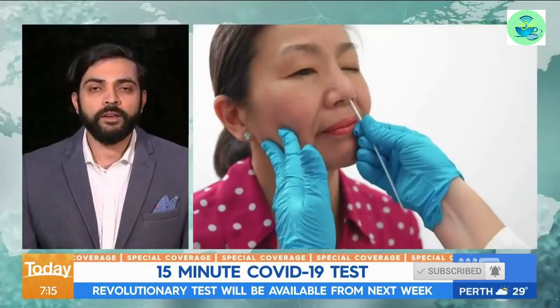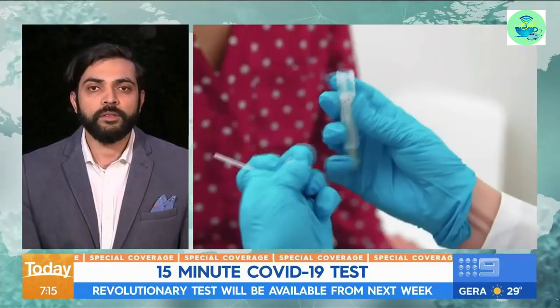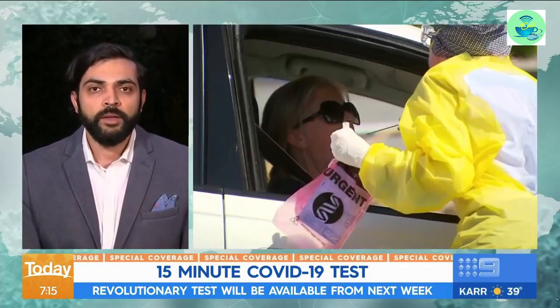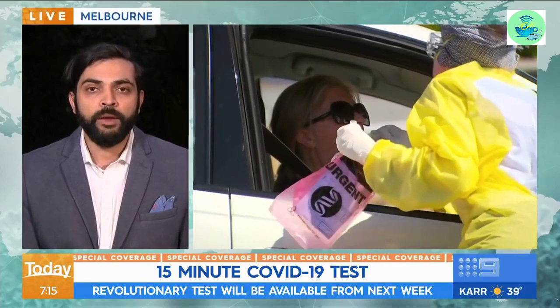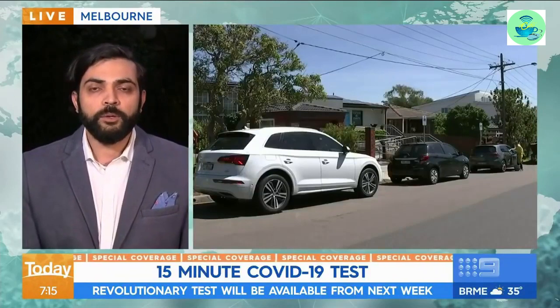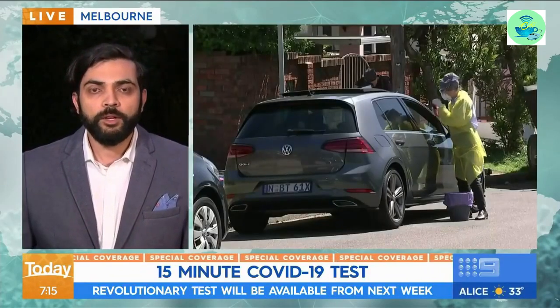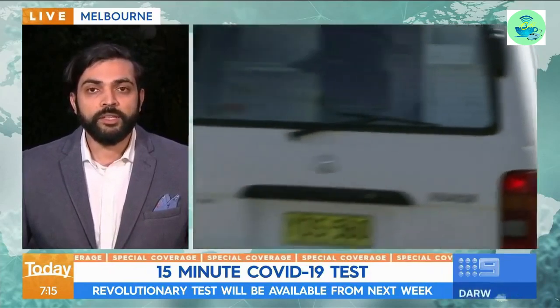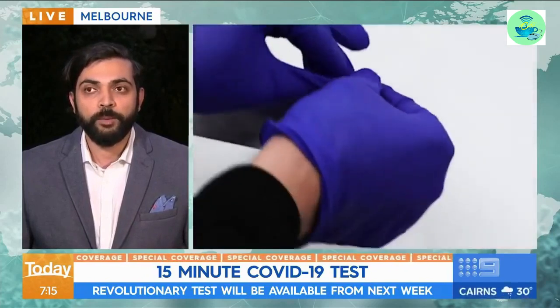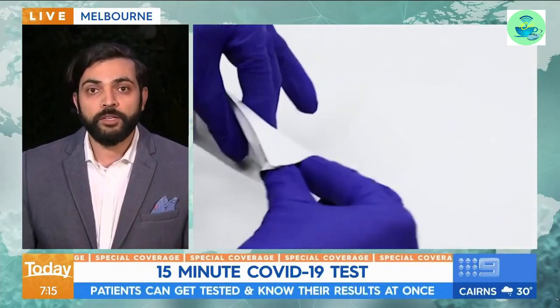Yes, absolutely. So it looks a little bit like a pregnancy test, and the science is called an immunoassay. Basically, when our bodies contract the virus, our immune system recognizes it and develops an immune response by making antibodies such as IgM and IgG within days to weeks. The test requires a few small drops of blood, similar to how much you would need after a pinprick when people with diabetes check their blood sugar.